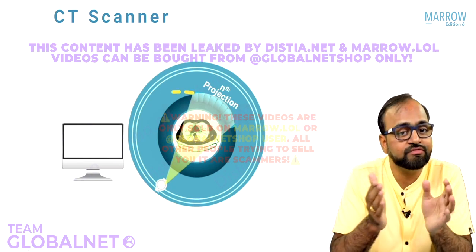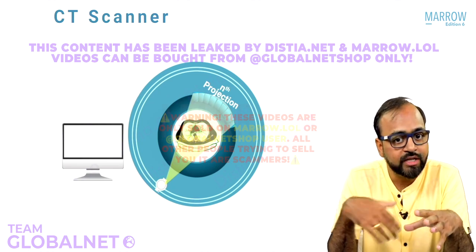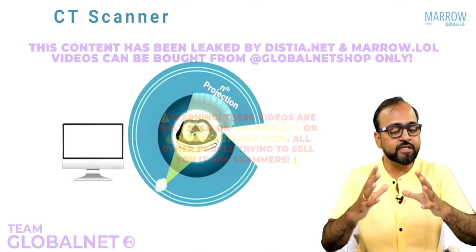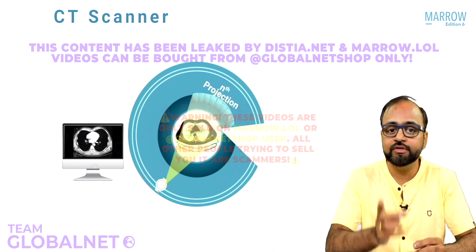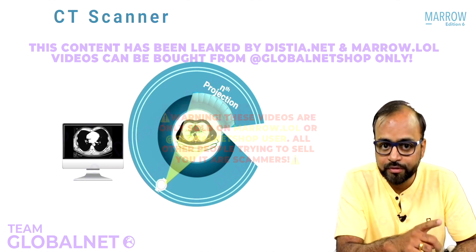All this data is fed to the computer. As I said, now what the computer does at the end, when all the n number of projections are obtained, the entire data is now processed together, right? And from this projection data, the computer is going to create a cross-sectional image of the patient's body, which is going to be displayed on the screen of the computer, right?